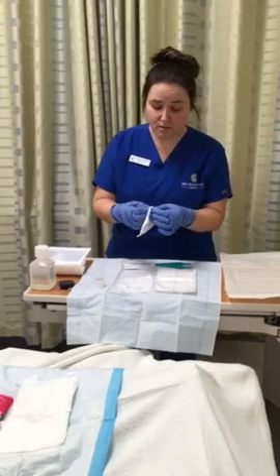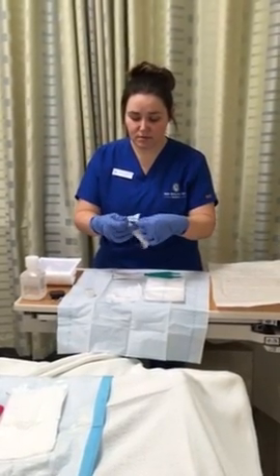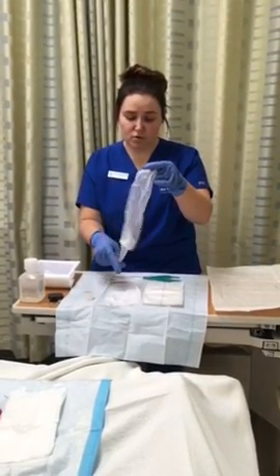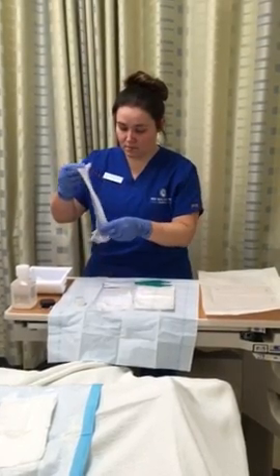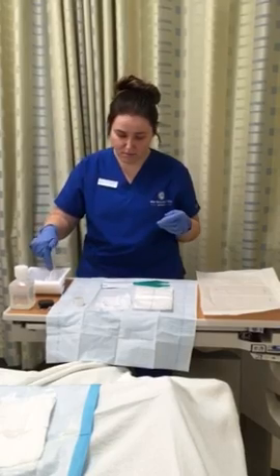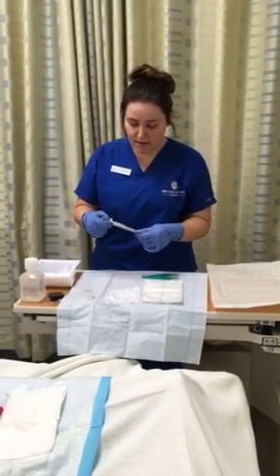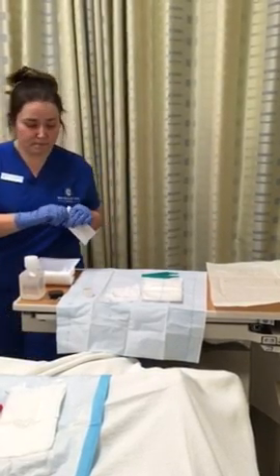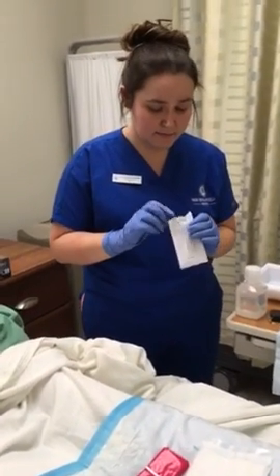And because there were 2 that I took out of my patient's wound, I'm going to be replacing them with 2 more. Okay. Now that I've gotten that done, I'm going to go ahead and clean the patient's wound without turning my back to my sterile field.